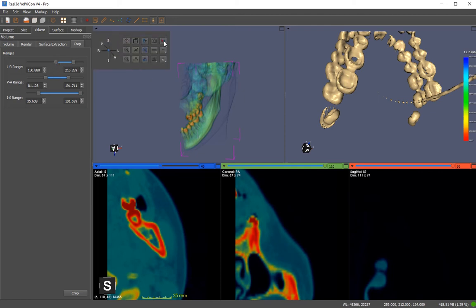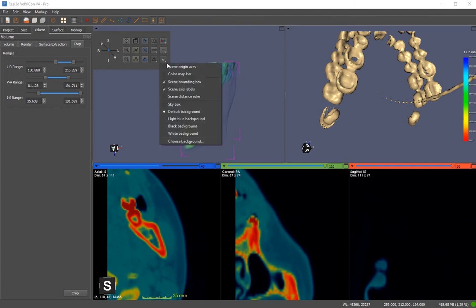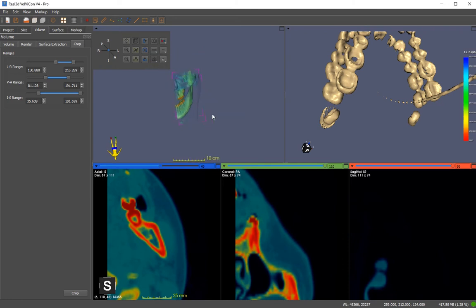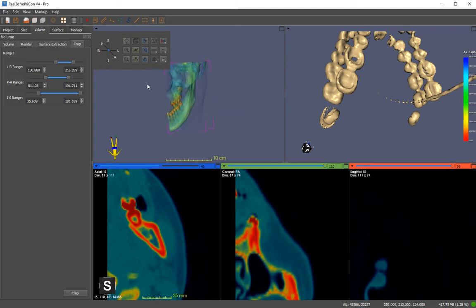The volume view has stereo options if you have goggles. You can enable deep viewing. If you are creating a plane over the volume you can enable or disable different features available in the volume view. You can also add a skybox — if you have six skybox images you can import them as a skybox. The ruler is only available in parallel projection, so it automatically turns on parallel projection if you are in perspective projection.